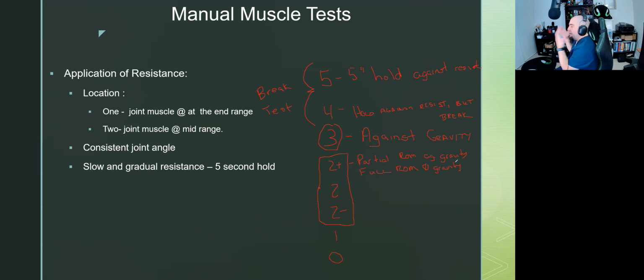Because I'm still coming up into that kind of sagittal plane. I need to almost move it into more of a frontal plane motion. Technically, it's transverse, really, but semantics. So if I go into my side, and I'm now laying on my side, gravity is going that way. So I'm going this way, which eliminates as much of gravity as I can.